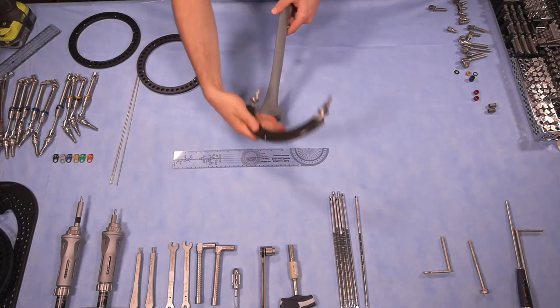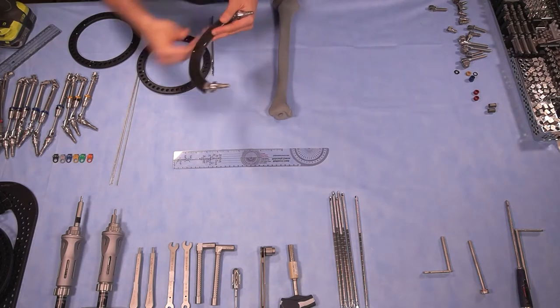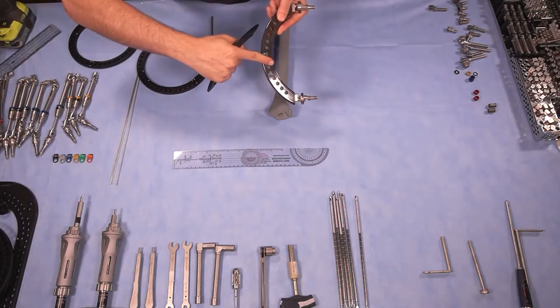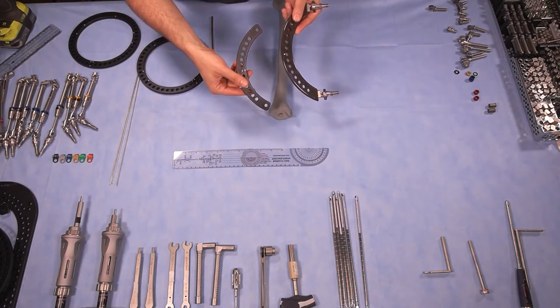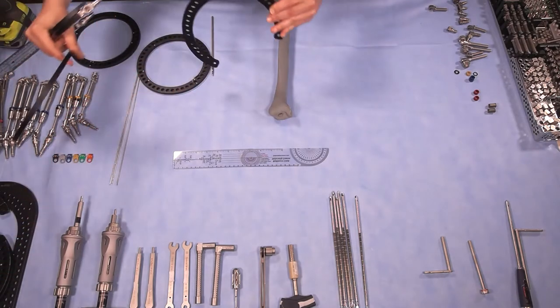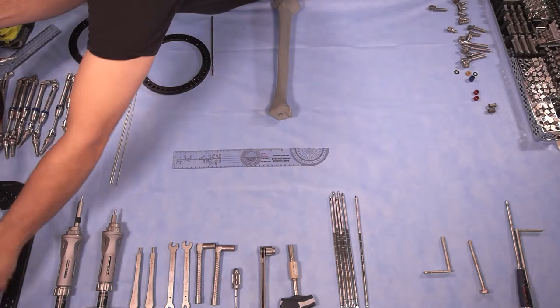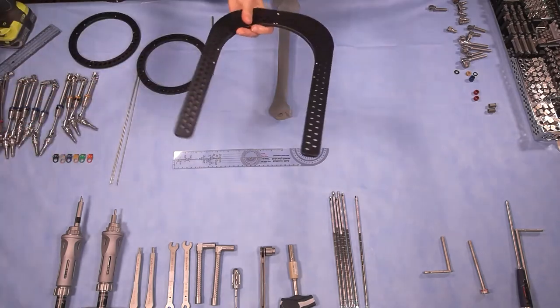If you need to extend the fixator to the foot, you could use arches made out of carbon fiber or aluminum, two-thirds rings, or foot rings.